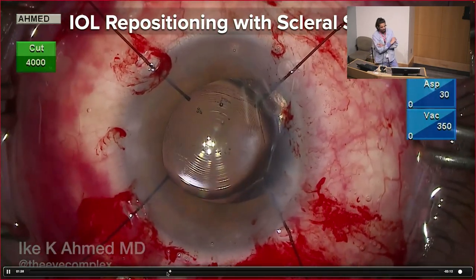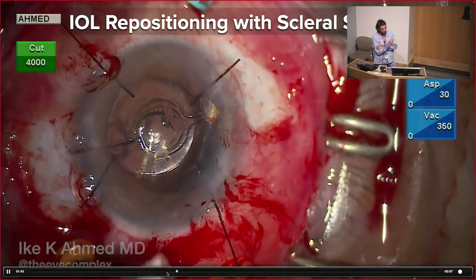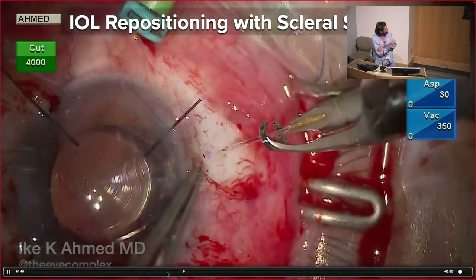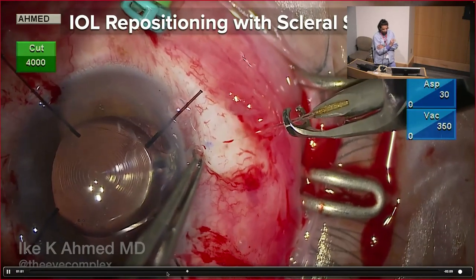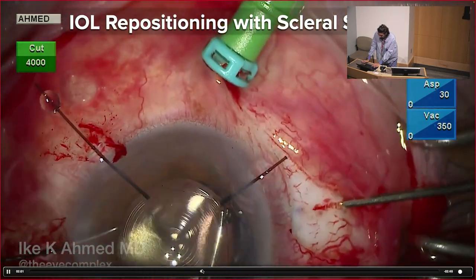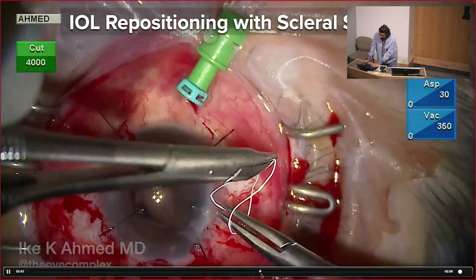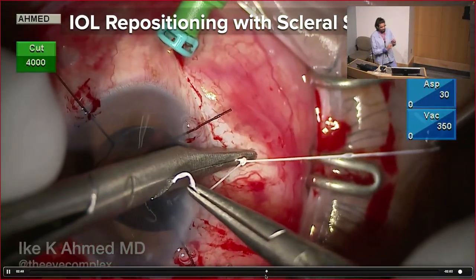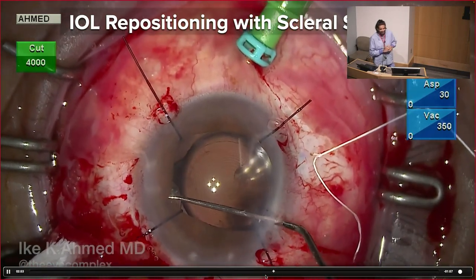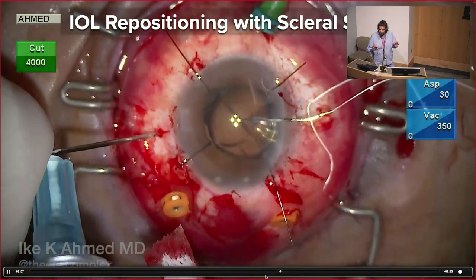And again, this is all about measurements, alignment, ensuring that we're adequately spaced apart. I'm placing my marks to center the sutures again at that 1.5 from the posterior blue zone. And basically, this is, again, a very similar approach. There's our needle passes. We're going around the haptic and the CTR. Second pass made there, and there we have our loop. I like to do a slip knot because probably the hardest part of these techniques isn't the suture pass, it's the tension, exactly, Dr. Olson. And we often spend 5-10 minutes on the table to adjust that.